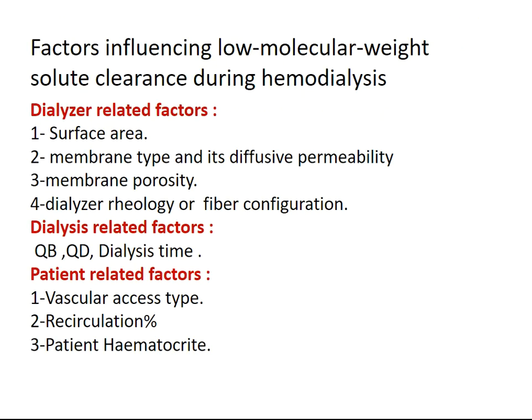Factors influencing low molecular weight solute clearance during hemodialysis are either dialyzer-related factors, dialysis-related factors, or patient-related factors.